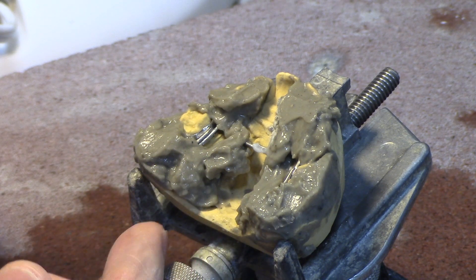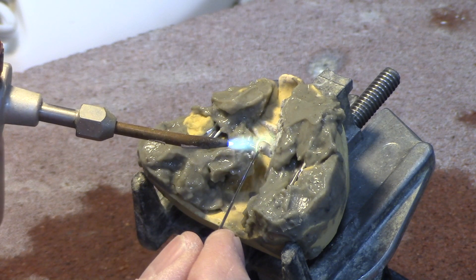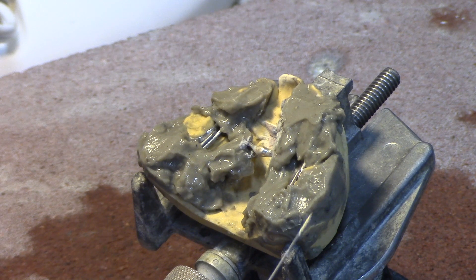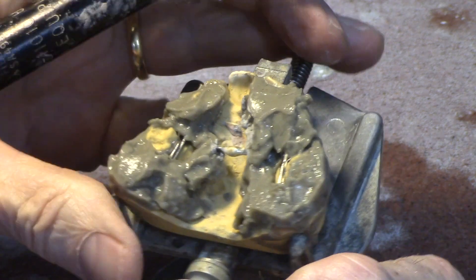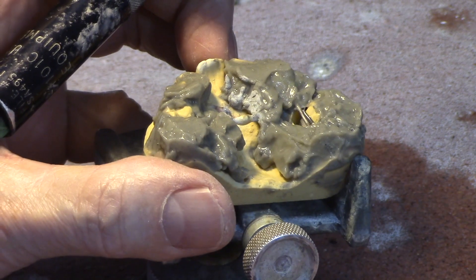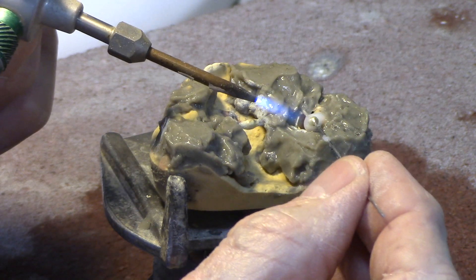I'm going to do this little spring solder first. I want just enough heat to melt the solder, and that should be plenty. I should have enough solder on there to fully encase the wires — I want that done. And it looks like we did it. Now I'm going to put some more flux on this area over here and heat it up so it'll kind of move around a little bit.